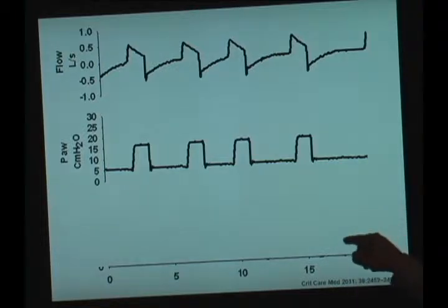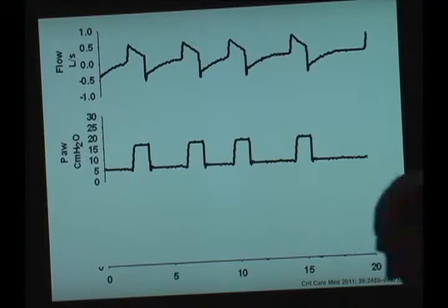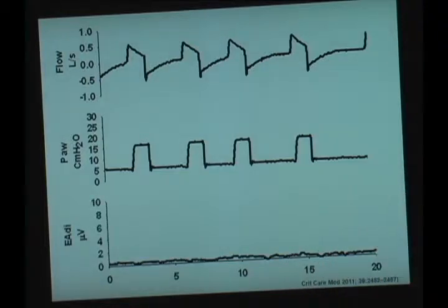But if we go to see the electrical activity of this patient, we saw this, flat. It's a paralyzed patient. Neuromuscular patient. It's not paralyzed. I mean, oh, okay. It's not paralyzed.